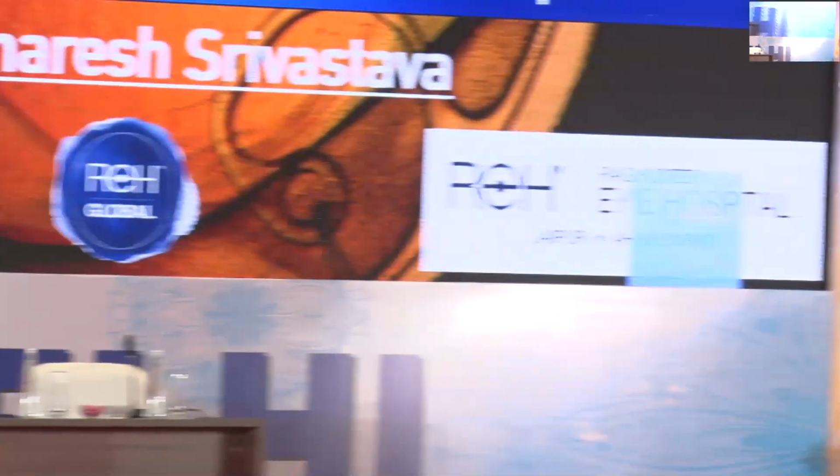So actually what I can think of is, what is a little bit missing there is the fact that it's subjective again to see the ring, when you're trying to make out if it's ovalized or centralized. But if you have an intraoperative guidance system, say like a Verion or a Callisto, you can actually put that Rexis marking, size it to the right size of that ring and overlap it to see if you are actually becoming more circular or not.